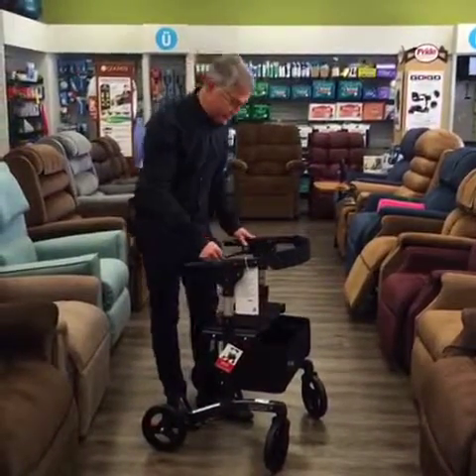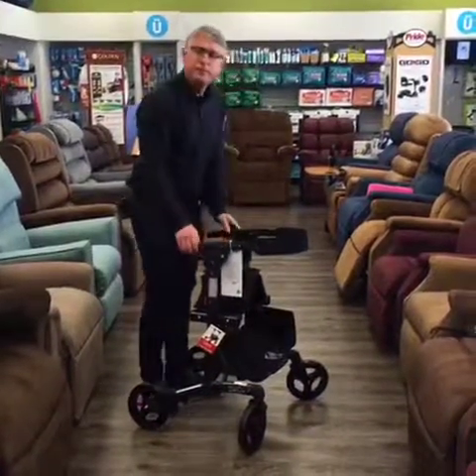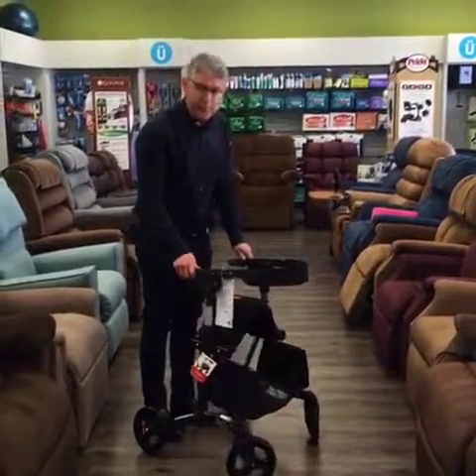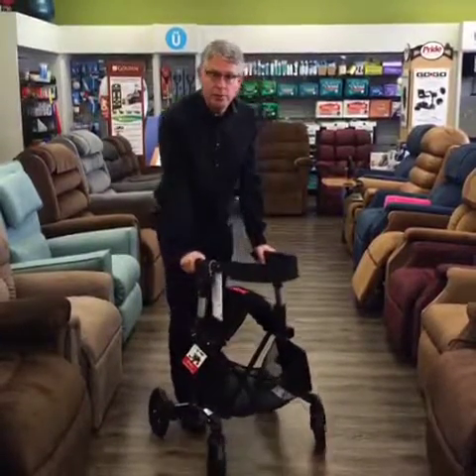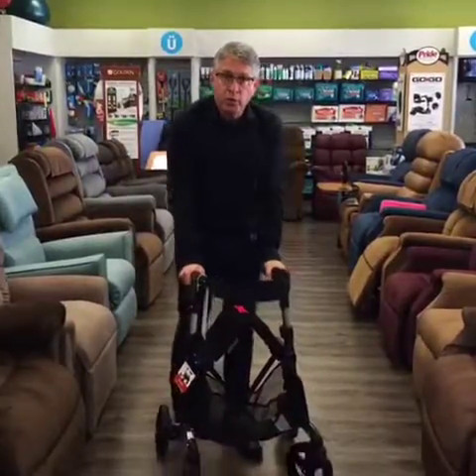Let me show you how it closes up. A quick pull of the handle and it shortens the distance, enabling you to go through narrow doorways nice and easily. That's a big factor, especially in older homes. The beauty of this is it's weight bearing without opening up in a partially closed position, allowing you to have full support of the rollator while going through a small door.